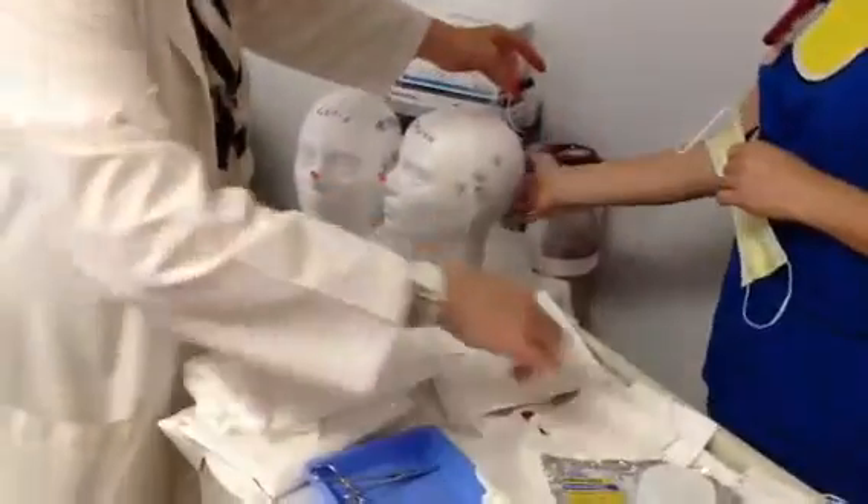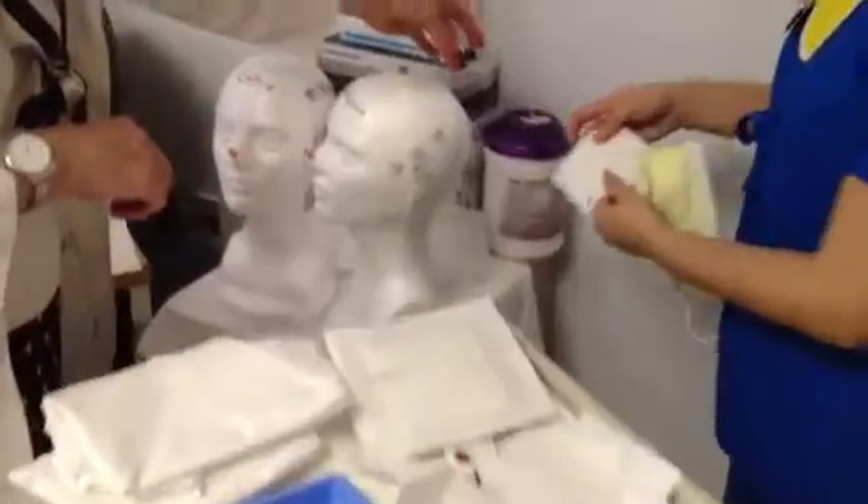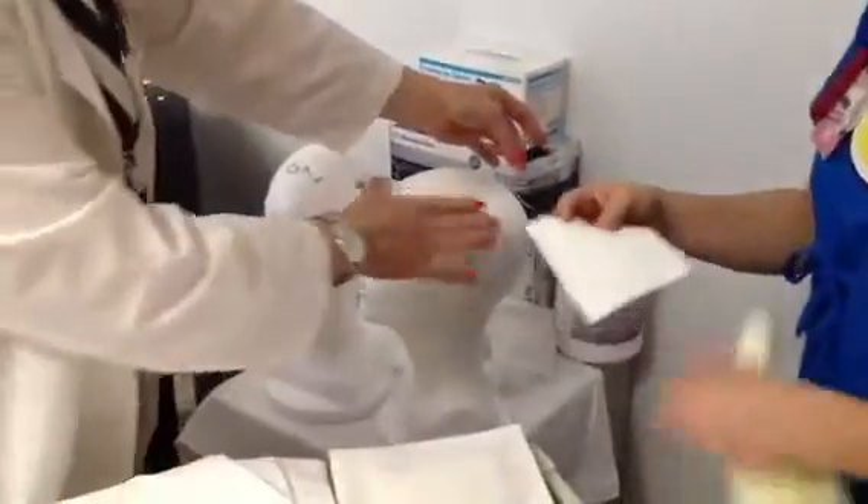This is Jodi. Now put your 4x4. No, no, open it up. No, no, not there — you want it over here.